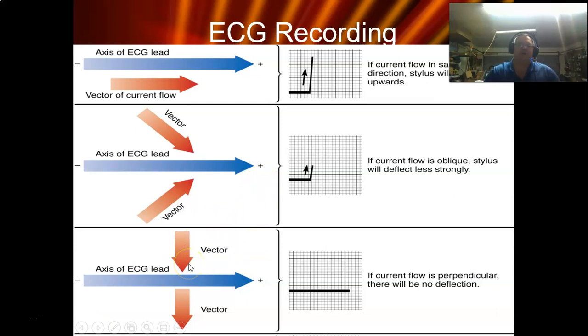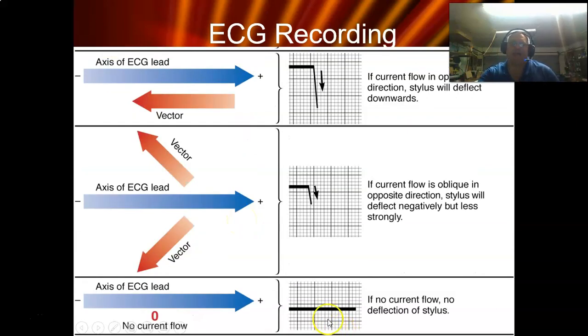And we're going to be talking about the axes here in a minute. What direction is the current flowing in, okay? And that's what we're trying to determine when we're determining axis. And that's what helps us define what disease process they're having, okay?